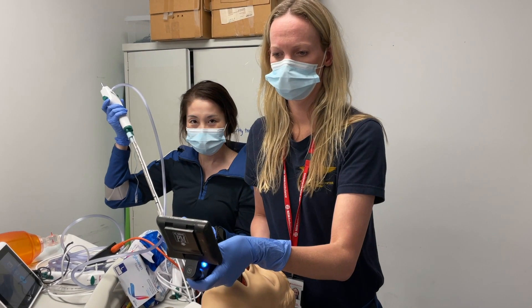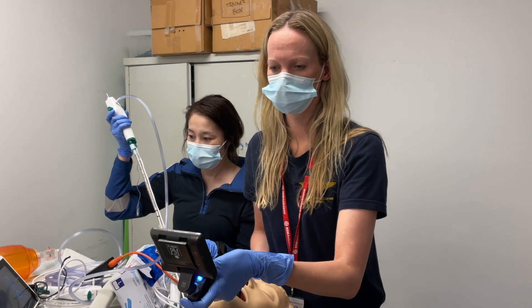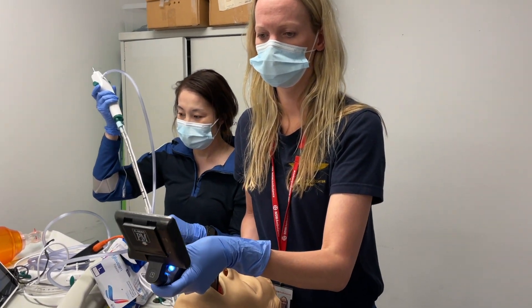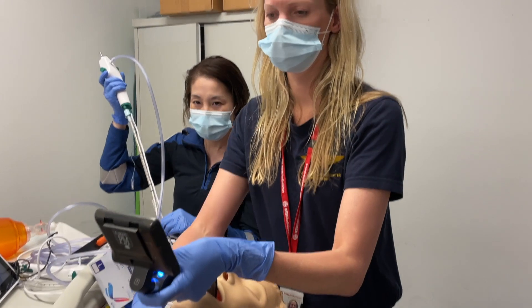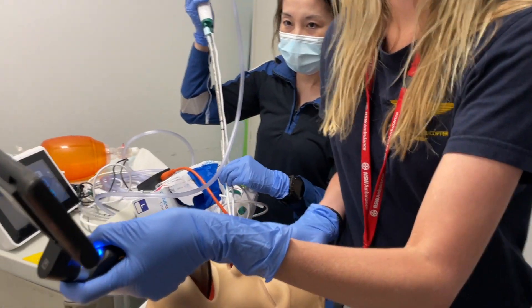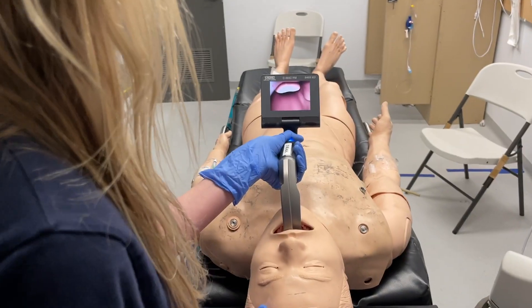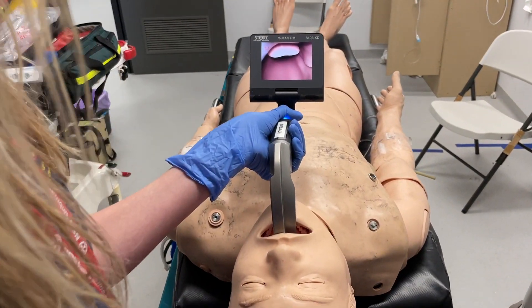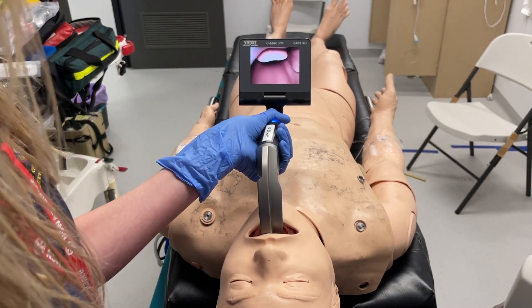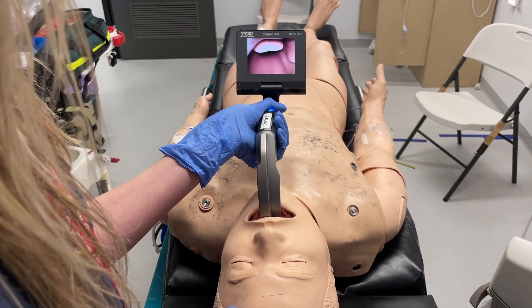The Sydney HEMS team is going to demonstrate Video Assisted Flexible Intubation, or VAFI. We've got our hyper-angulated blade — in this case the CMAC blade — in place. Our primary operator has at best a Grade 3 view with the epiglottis only.